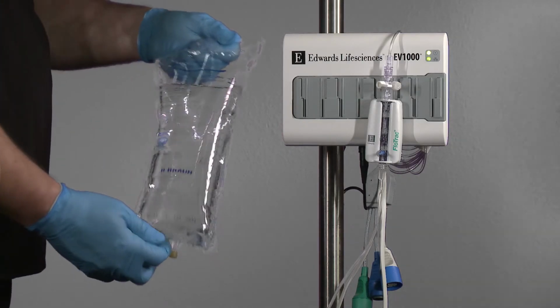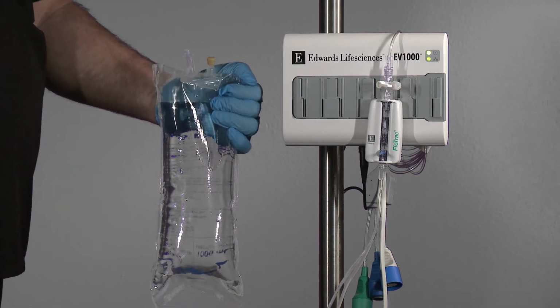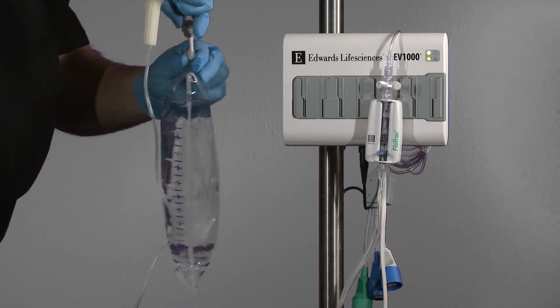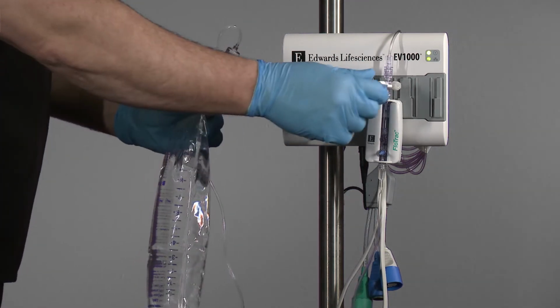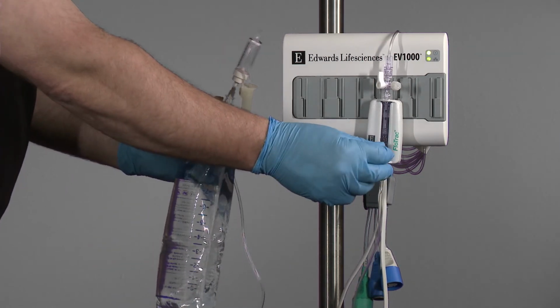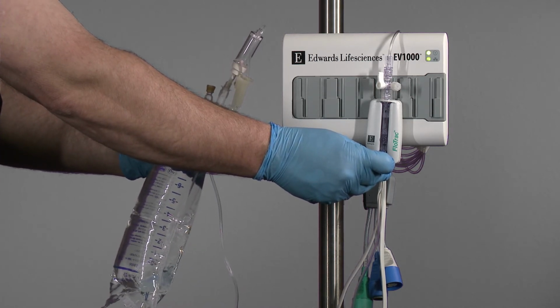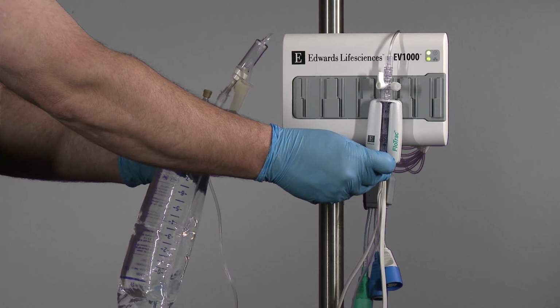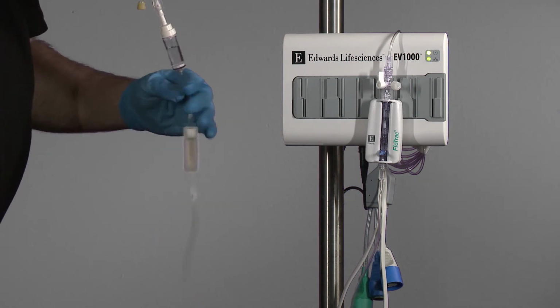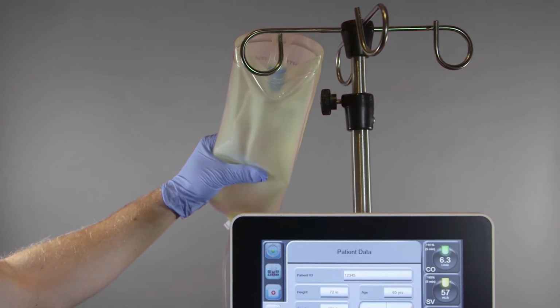Invert the flush bag, allowing air to rise to the base of the bag. Spike flush bag with fluid administration set. Turn the FloTrac sensor stopcock toward the pressure tubing. While keeping bag inverted, place pressure on the bag with one hand while pulling the flush tab on the sensor to evacuate air from the bag, and fill the drip chamber halfway or full, depending upon institutional preference. Insert the flush bag into the pressure infuser bag and hang on the IV pole, but do not inflate the infuser bag.